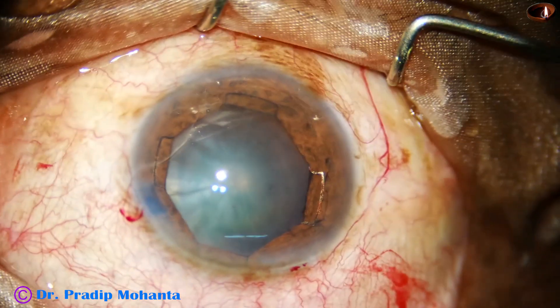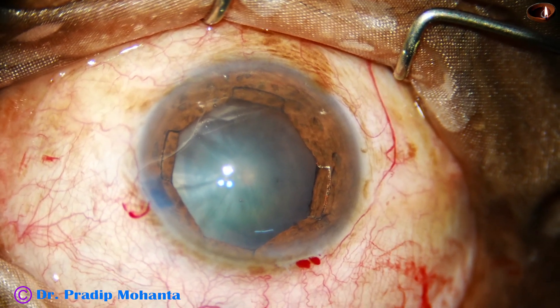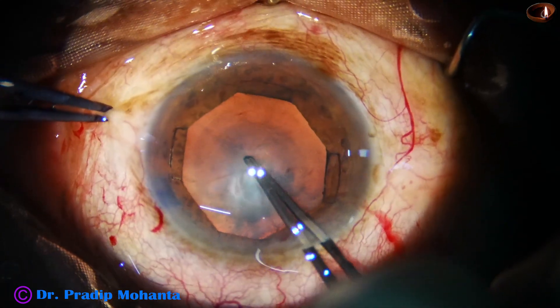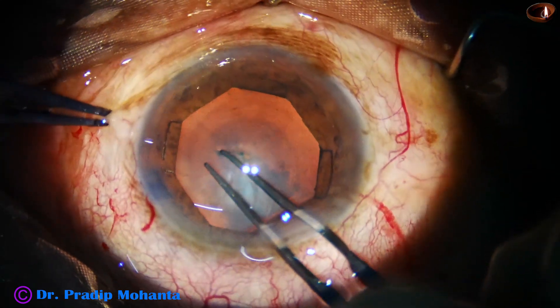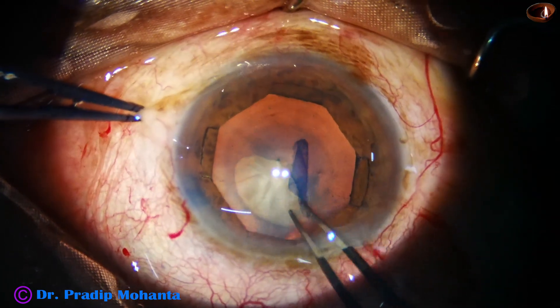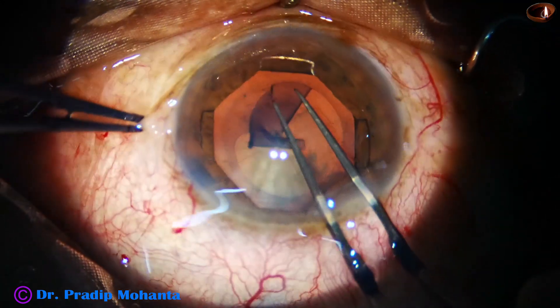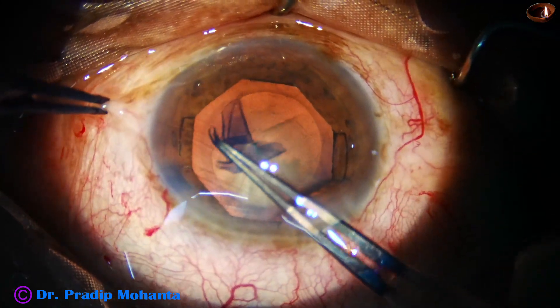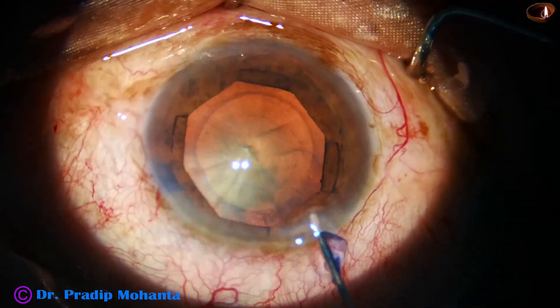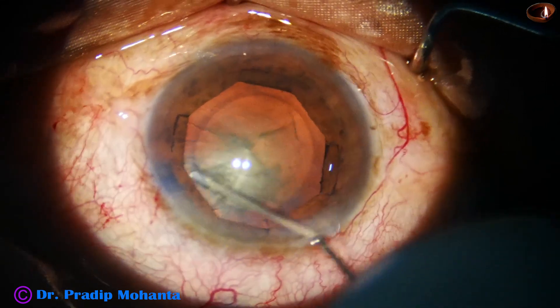One problem in IFIS with B-Hex is that in some cases there will be a component of LIDRS — that is Lens-Iris-Diaphragm Retropulsion Syndrome. Whenever you go with irrigation and you have already engaged the B-Hex, because of reverse pupillary block the pupil dilates and the whole B-Hex may come anteriorly. It has happened to me once or twice.